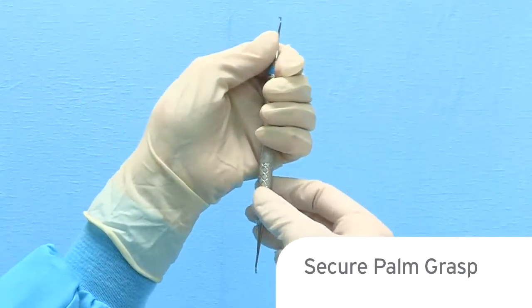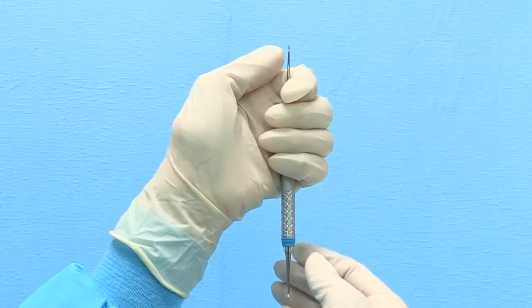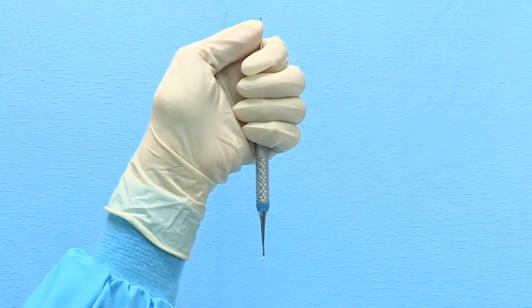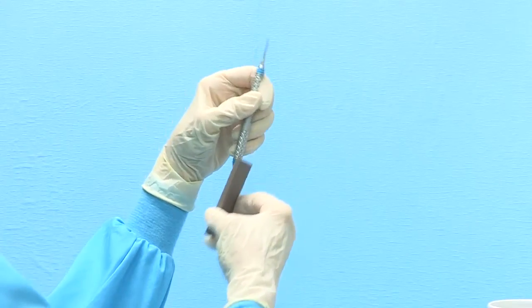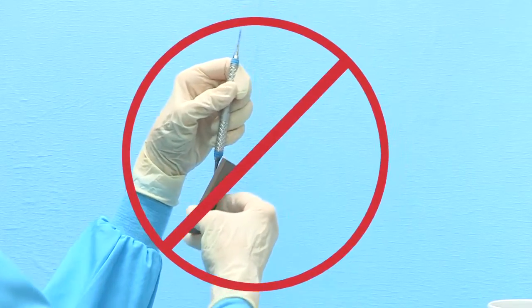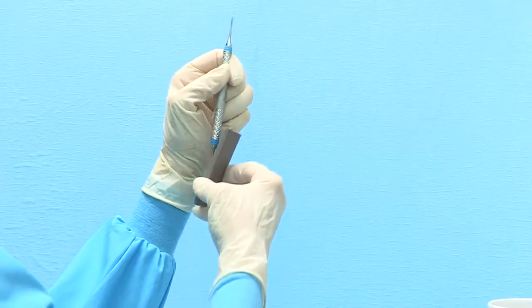When sharpening, a secure palm grasp with the instrument held in the palm of the hand and the thumb near the top shank is necessary to counterbalance the pressure from the sharpening stone. When the pressure from the stone is not counterbalanced, the instrument can slip out of position. This will cause the sharpening angles to be incorrect and can result in an instrument that does not have sharp cutting edges.